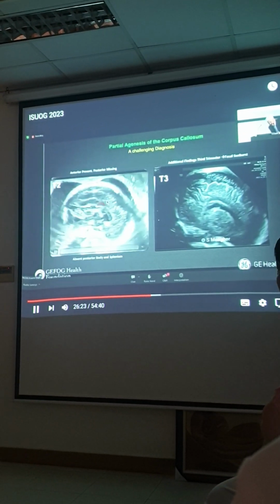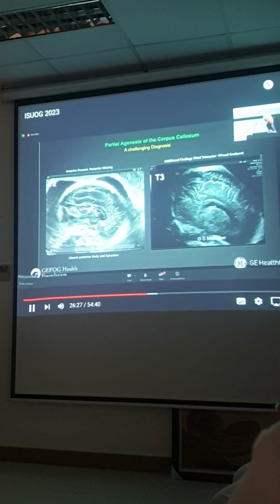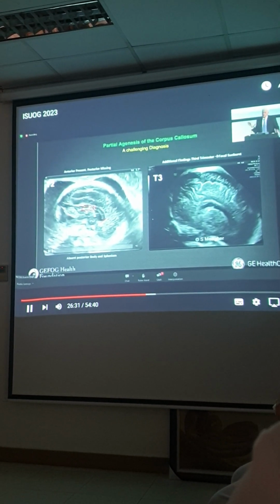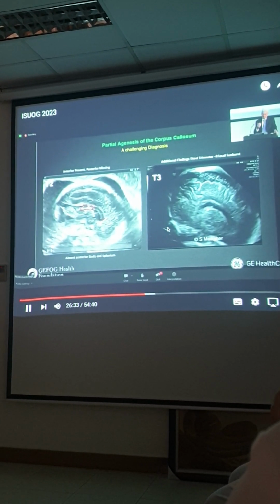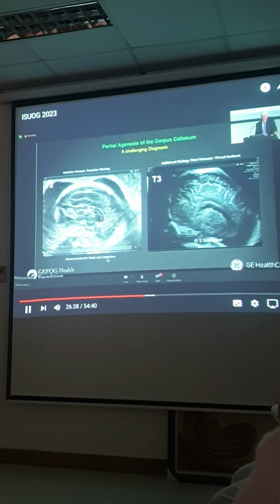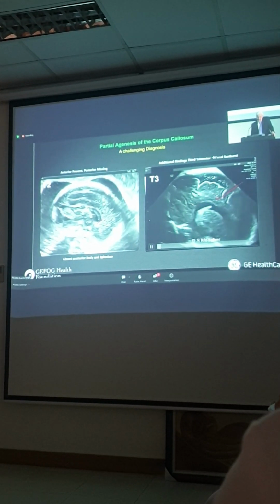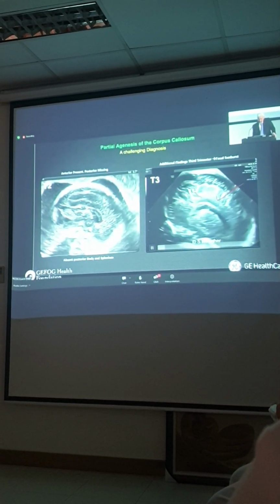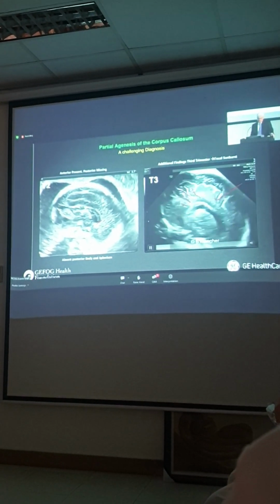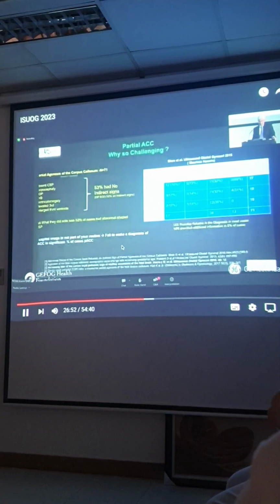Phần trước nó điều gì này, mà thật sự đúng là nhiều khi mình cắt cái tư thế thai nó không thấy trọn, đâu phía sau này mình không thấy nổi. Cái thế em bé nhiều khi cũng khó chịu dữ lắm. Này nó mất cái phần thân phía sau. This is the most common form of partial agenesis.